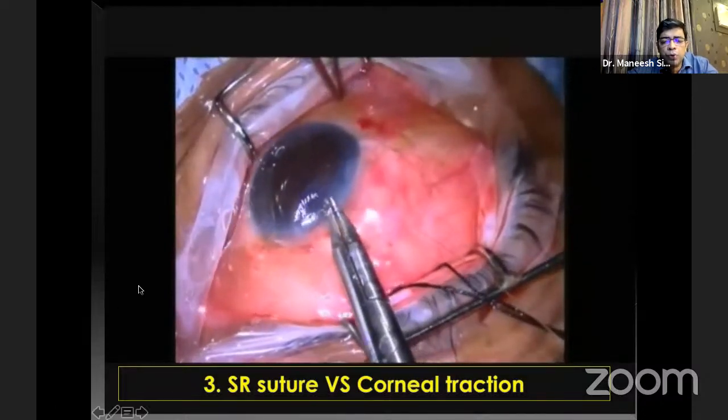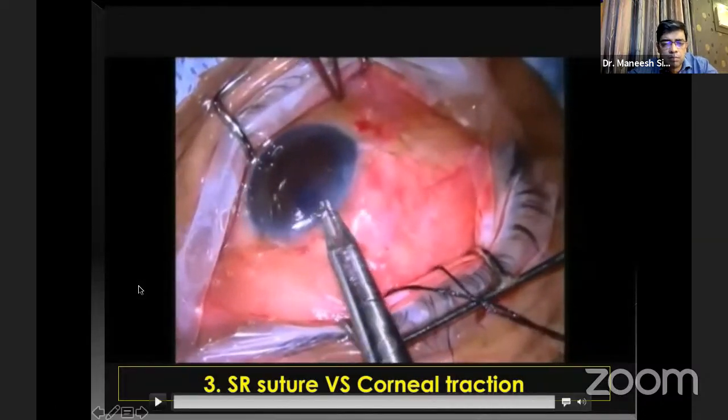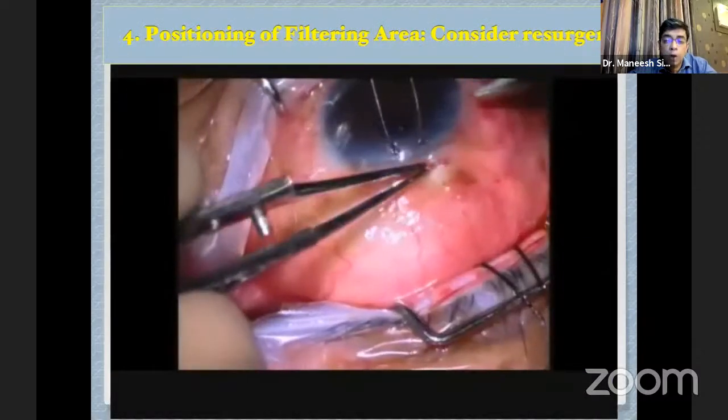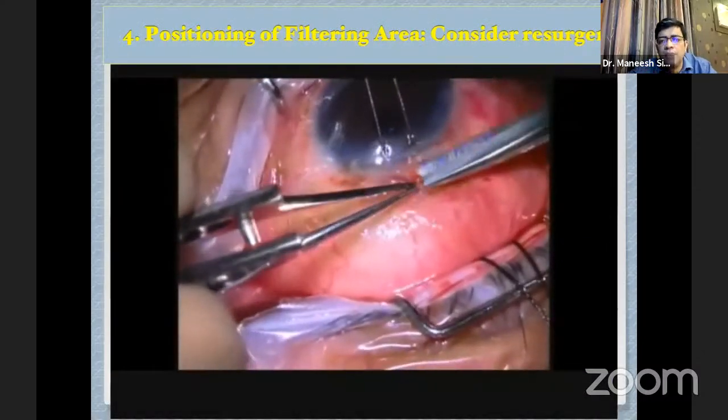Whether you should use a superior suture or a corneal traction, personally I believe corneal traction is the better option because you have no chance of hematoma formation or bleeding from the superior suture. With a superior suture, if there is bleeding, blood we know is pro-fibrotic, so it can increase your risk of failure of trabeculectomy.